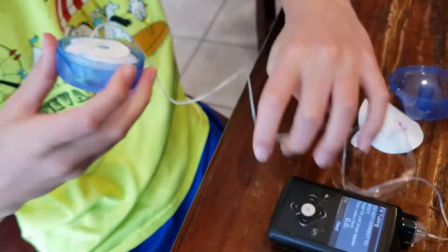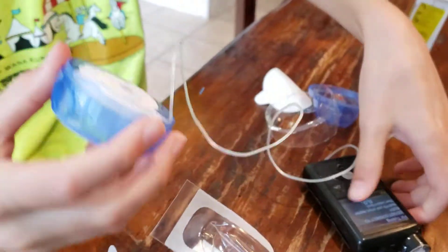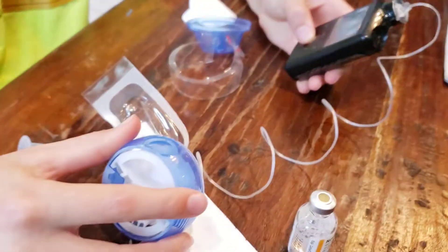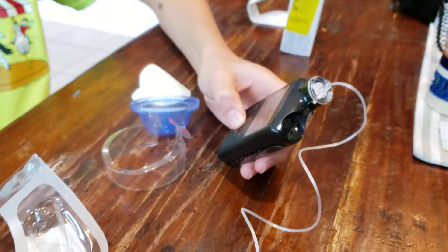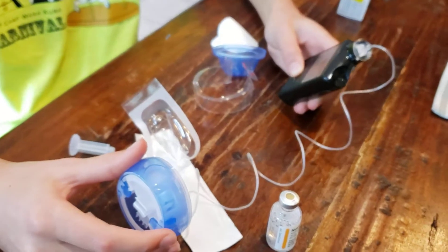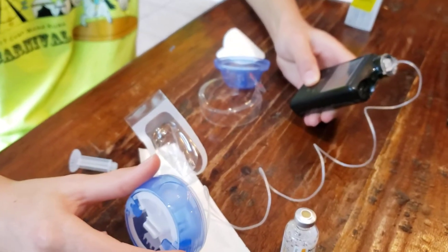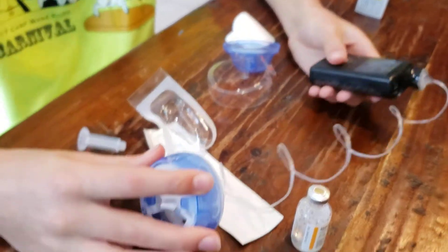Now what we like to do is turn it upside down, and then it's really important to pay attention. And then you hit fill — he's holding down fill. We're waiting for insulin drops to come out. Around seven or eight units, it'll start coming out.